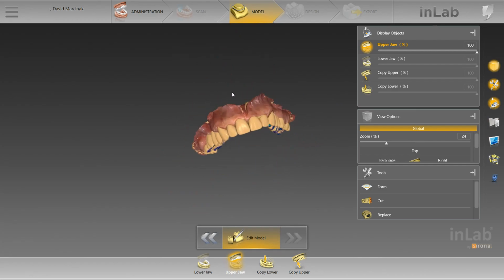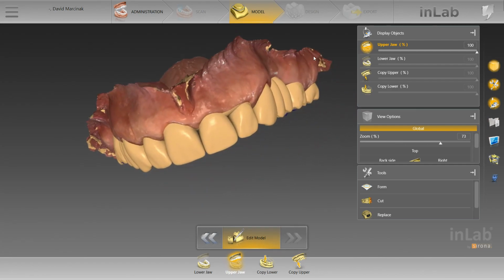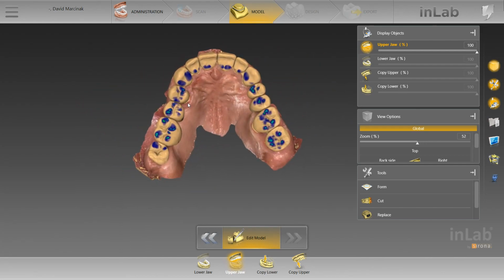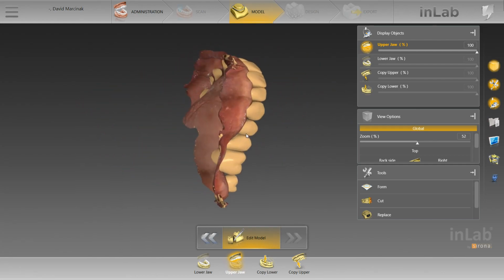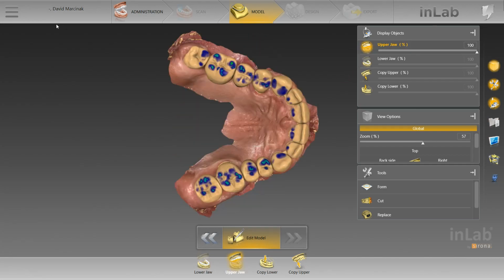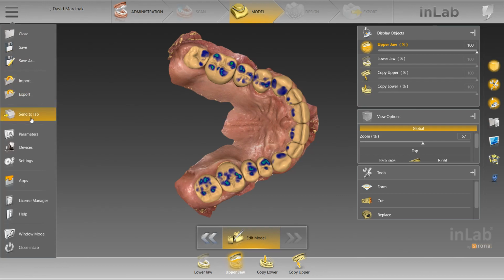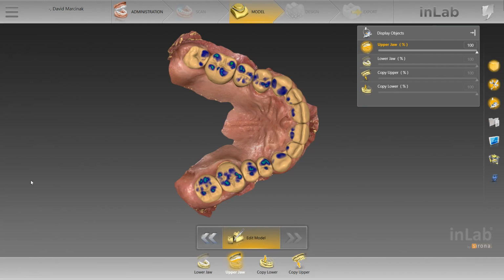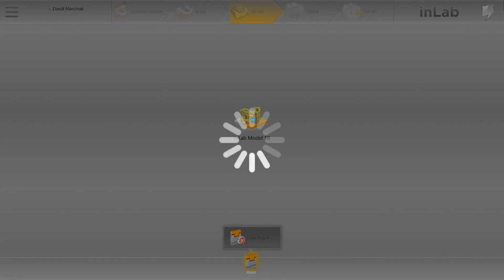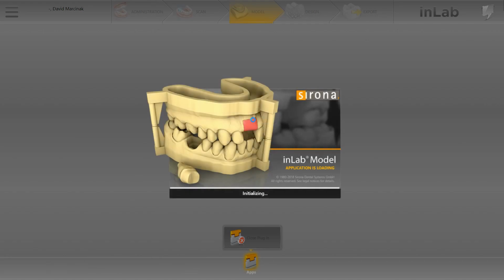And I'm also going to do another post with some photos of this, and you guys can get a really good in-depth view of what we had to work with. But now this is virtually seated, upper and lower jaw. Then you're going to go over here to Apps, from the drop-down menu, Apps, and then InLab Model 18. And this module is a free module that comes with the InLab CAD software.